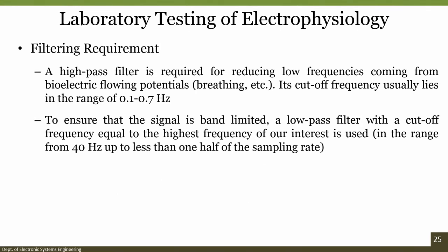For example, breathing, its cutoff frequency usually lies in the range of 0.1 to 0.7 hertz, while to ensure that the signal is band limited, a low pass filter with a cutoff frequency equal to the highest frequency of our interest is used, which is generally from 40 hertz up to less than one half of the sampling rate. So, these are the filtering requirements.